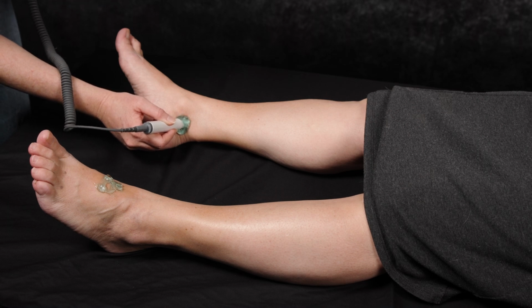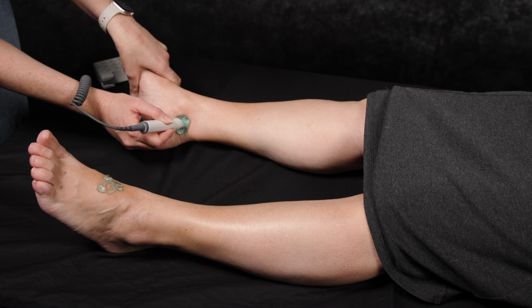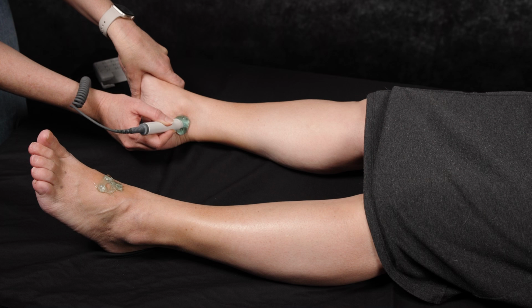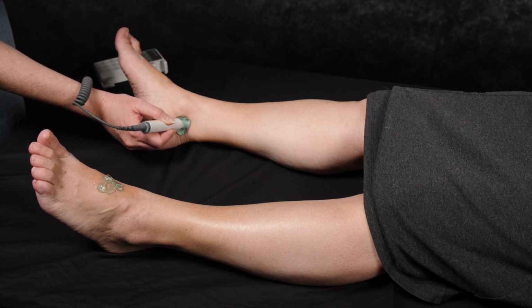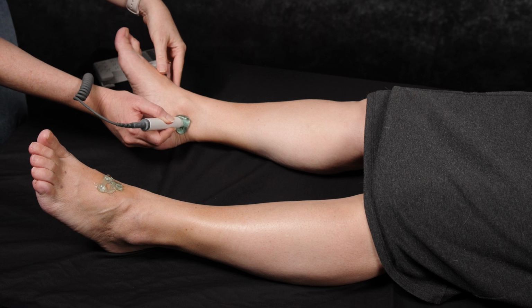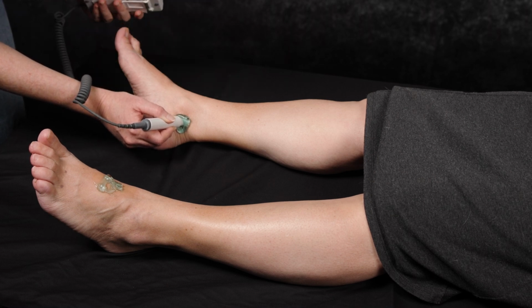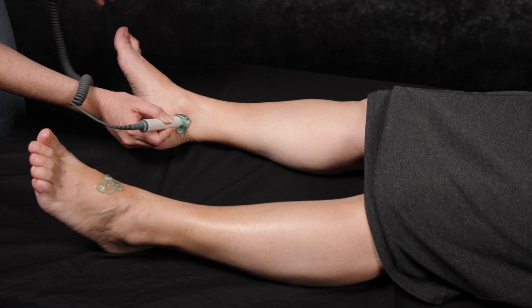That whooshing sound you can hear there is a vein. See when I give the foot a squeeze, you can hear the vein. So we know that the artery is located right next door. If I just move over a little bit, I'll be able to hear the artery. And that pulse has 3 sounds. 1, 2, 3, 1, 2, 3.